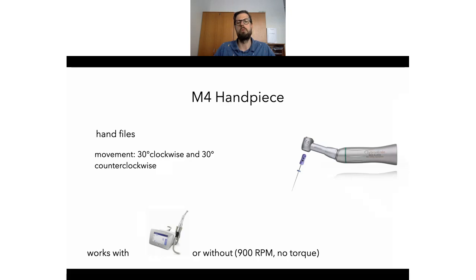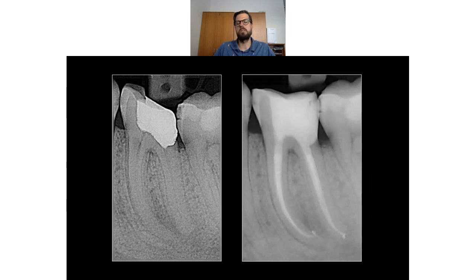So here is before, and here is after, and I must say it was a really, really difficult case. And if you take another look into the proximal area, into the gingival area, you see that we are really, really close to the bone. So we have been in the biological width, in the complex of the biological width.